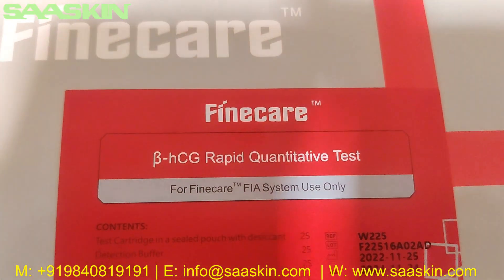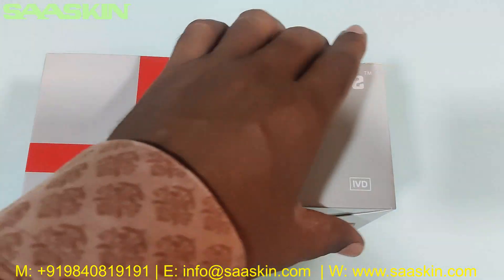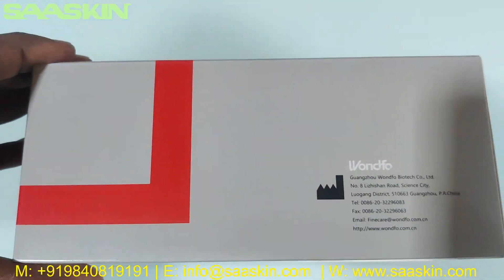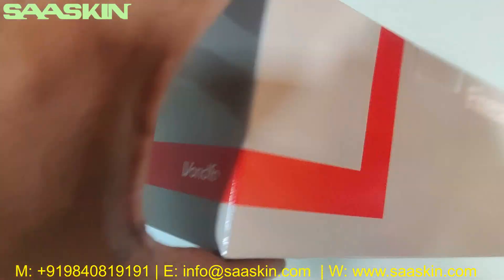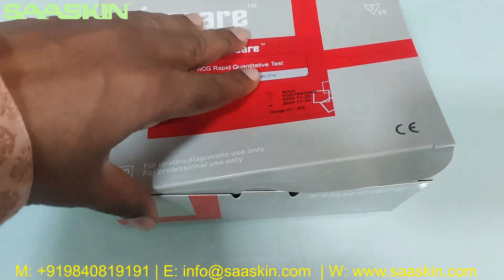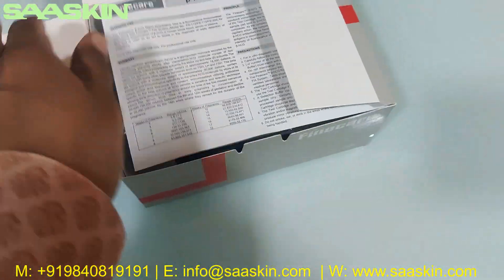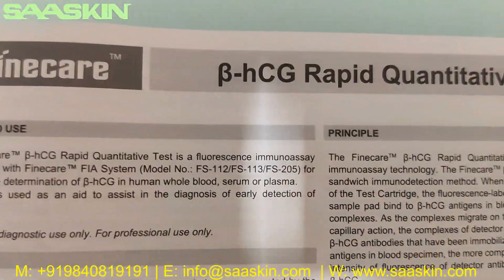We are seeing the Finecare Beta HCG Rapid Quantitative Test Kit. Let me go around this box — this is what the box looks like. I will unbox this for you. Inside the box you have an instruction leaflet for use. This says Finecare Beta HCG Rapid Quantitative Test.